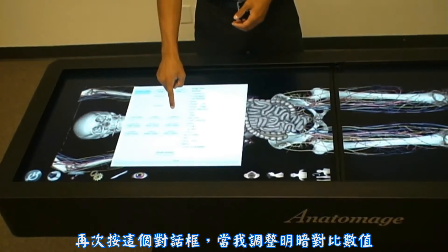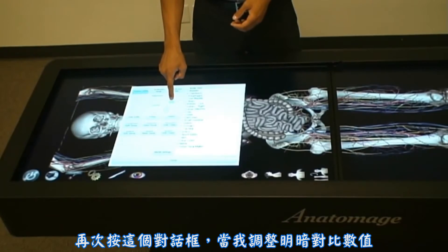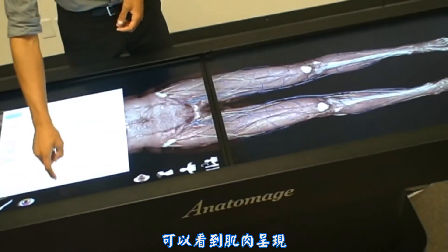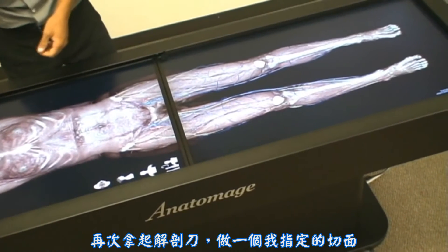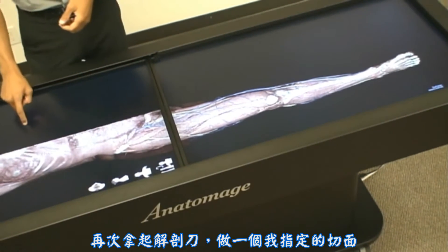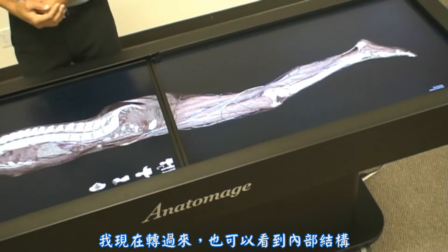Bringing up this dialogue again, as I adjust the contrast and brightness values, I can start to show the musculature underneath. Pressing the scalpel again, creating my own custom cutting plane, I can rotate around and look at the internal structures there as well.